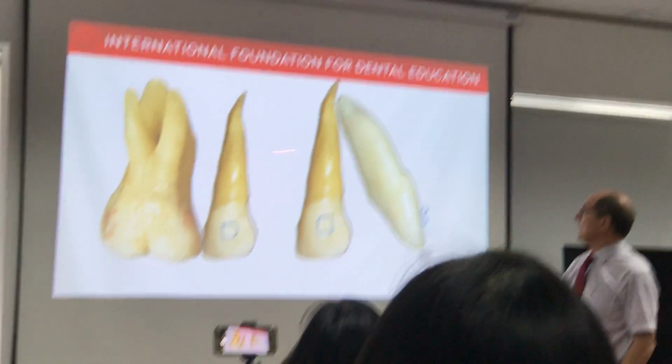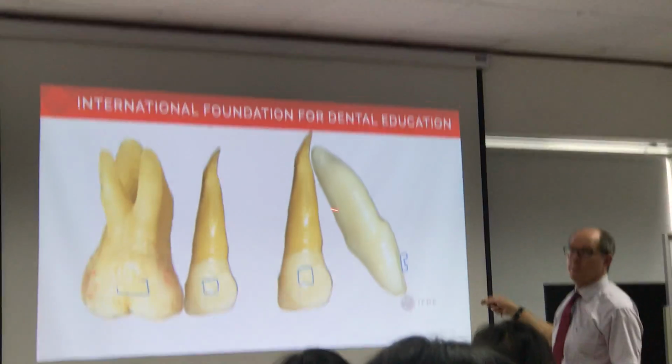And this is where I will always want to have a CBCT.